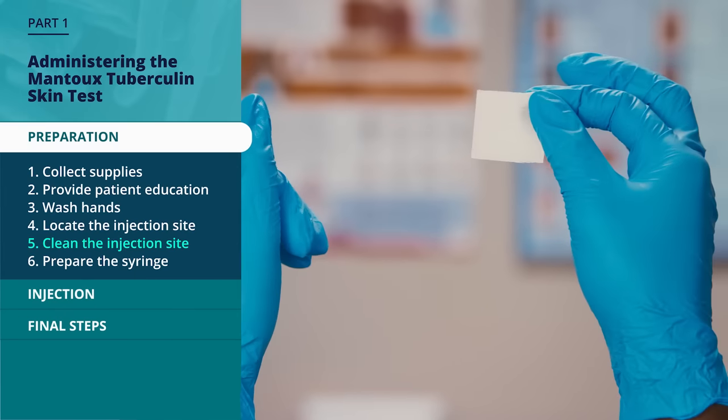In review, remember, when you read the Mantoux tuberculin skin test, you should collect the appropriate supplies, inspect the site, palpate the induration, mark the induration, measure the induration, not the erythema, and record the measurement.